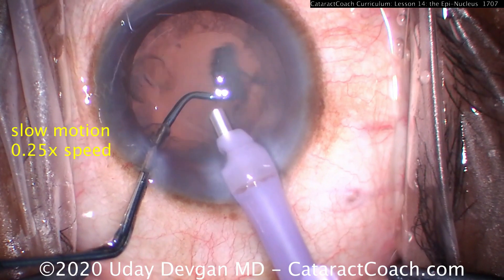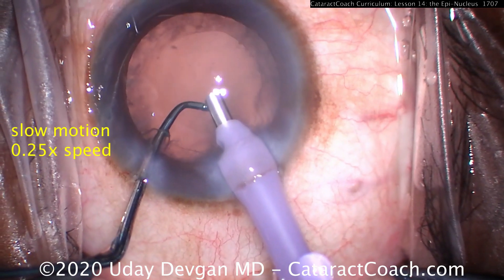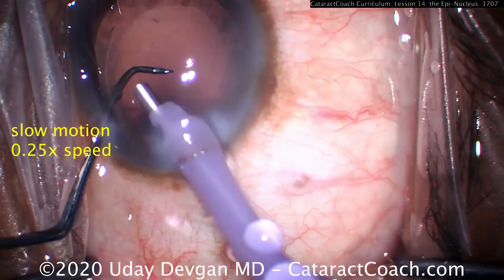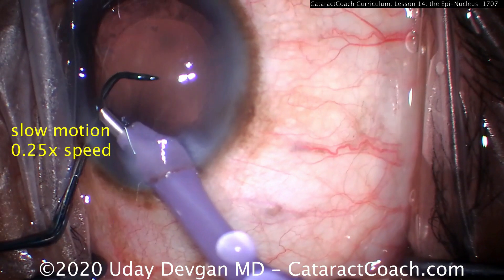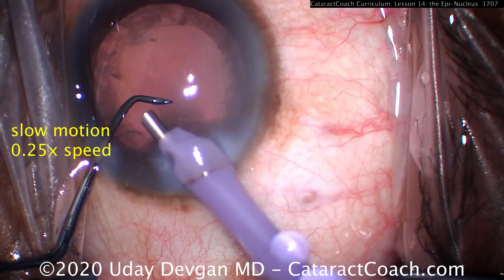Now it emulsifies very easily — we can even apply a little bit of ultrasound energy to facilitate it — and just like that, the entire epinuclear shell has been emulsified and is gone. A very efficient and very safe technique. This is the epinuclear flip: using that chopper to flip the epinuclear shell upside down.